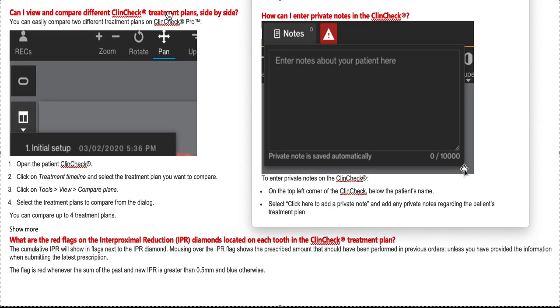First of all, yes, you can view various ClinCheck treatment plans side by side, which I love. A lot of times I'll work up multiple treatment plans — one with IPR, one without; one fixing midlines, one not; one just anterior movement, one with full movement with elastics fixing the bite. I might have three, four, five, six, seven, eight options. Now you can easily toggle — there was a toggle button before, but now there's a button on the top left. You can see the various setups and compare one with another — up to four treatment plans at one time — so patients can see A versus B and understand it.